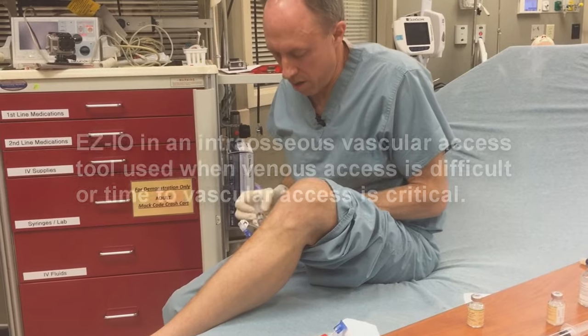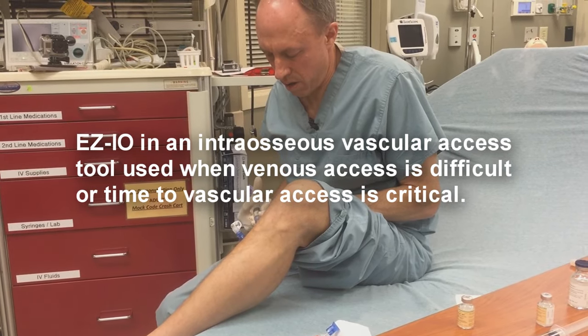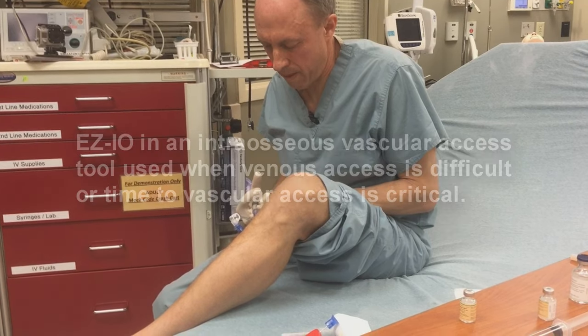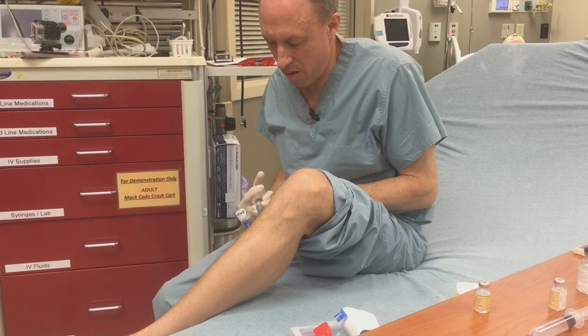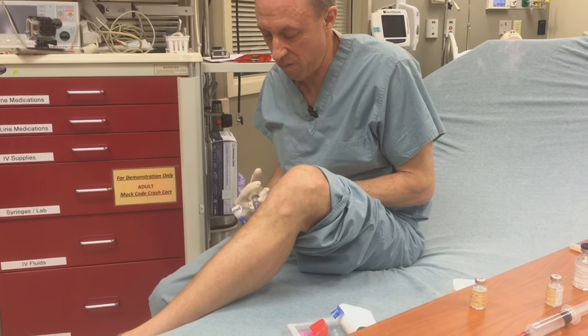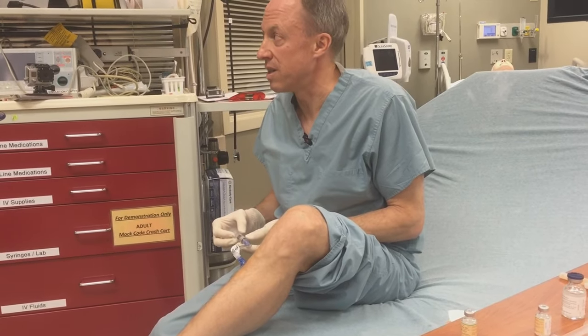Okay, there it is. So I'm going to push a little bit. If I push it slow, it doesn't hurt — well, it hurts, but it's tolerable. If I pushed it fast, it would really hurt. I can tell.